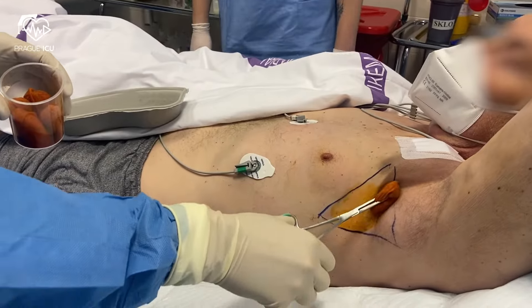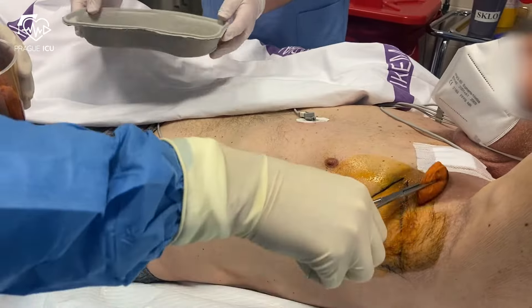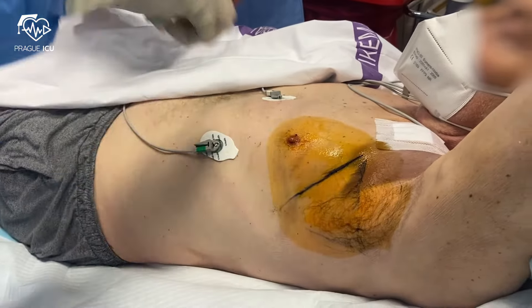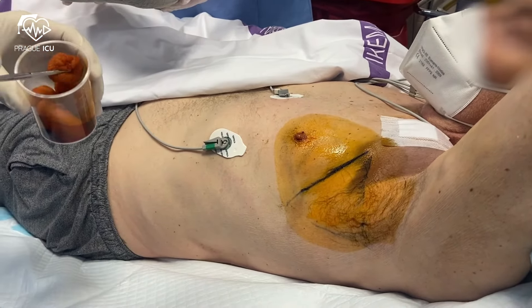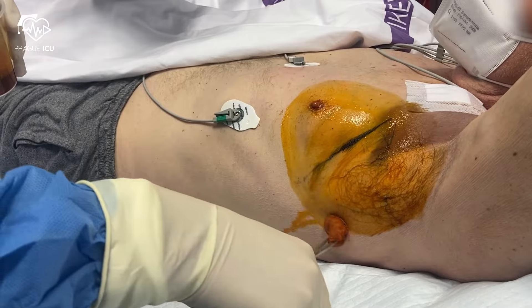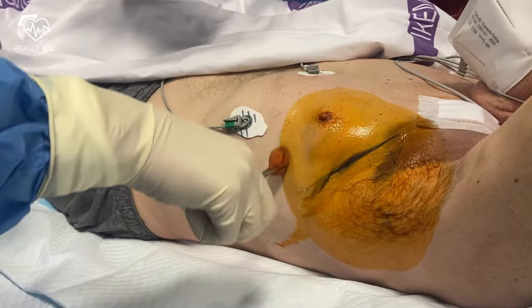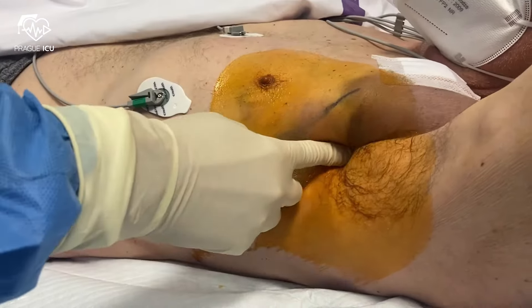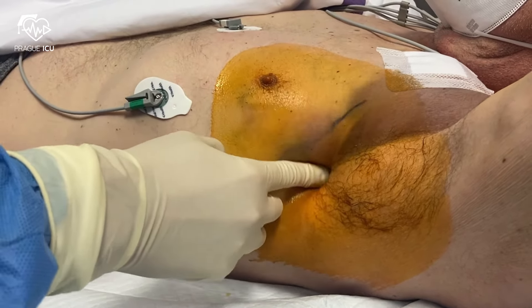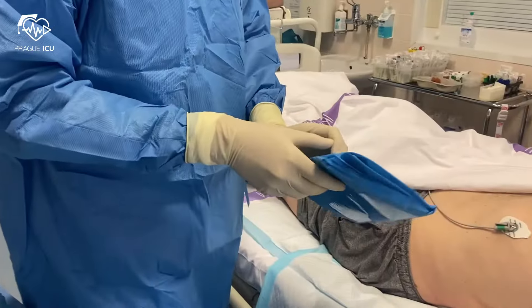First, apply the aseptic skin prep widely around the insertion site. Start from the center and move out, never come back to the center. Count the rib numbers and find the correct intercostal space. Never go lower than the 5th intercostal space as there is an increased risk of diaphragm or abdominal organ puncture.